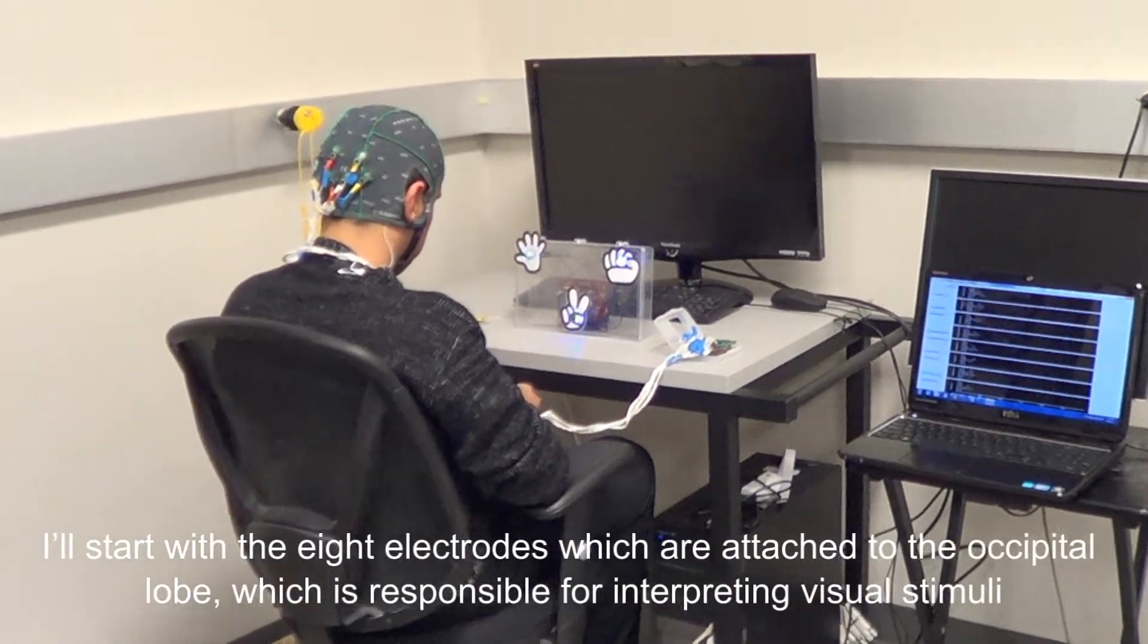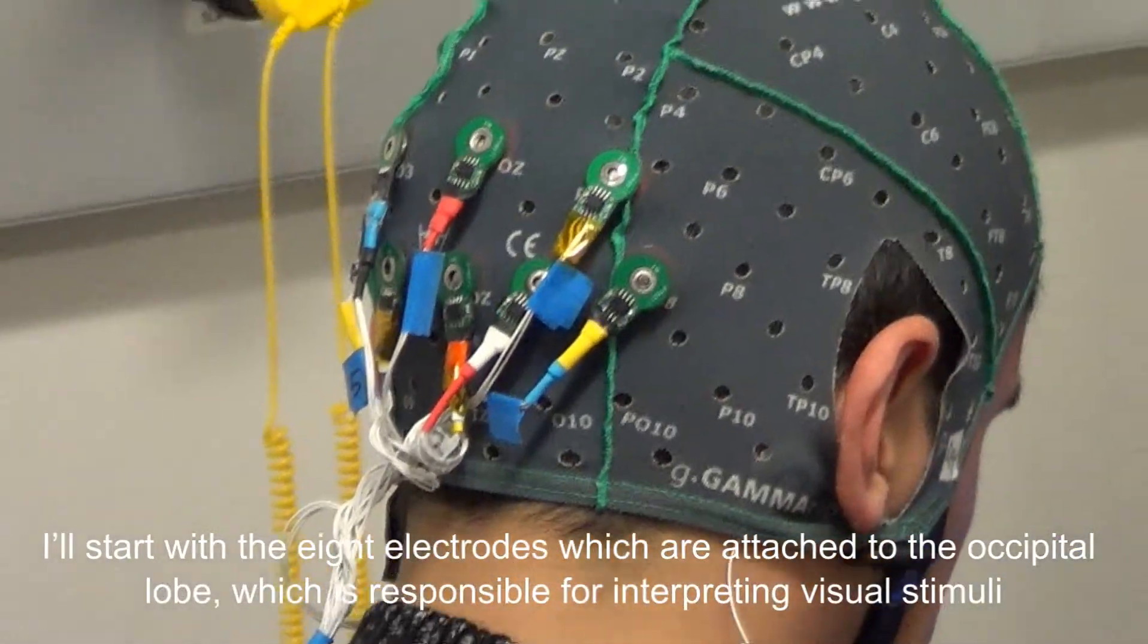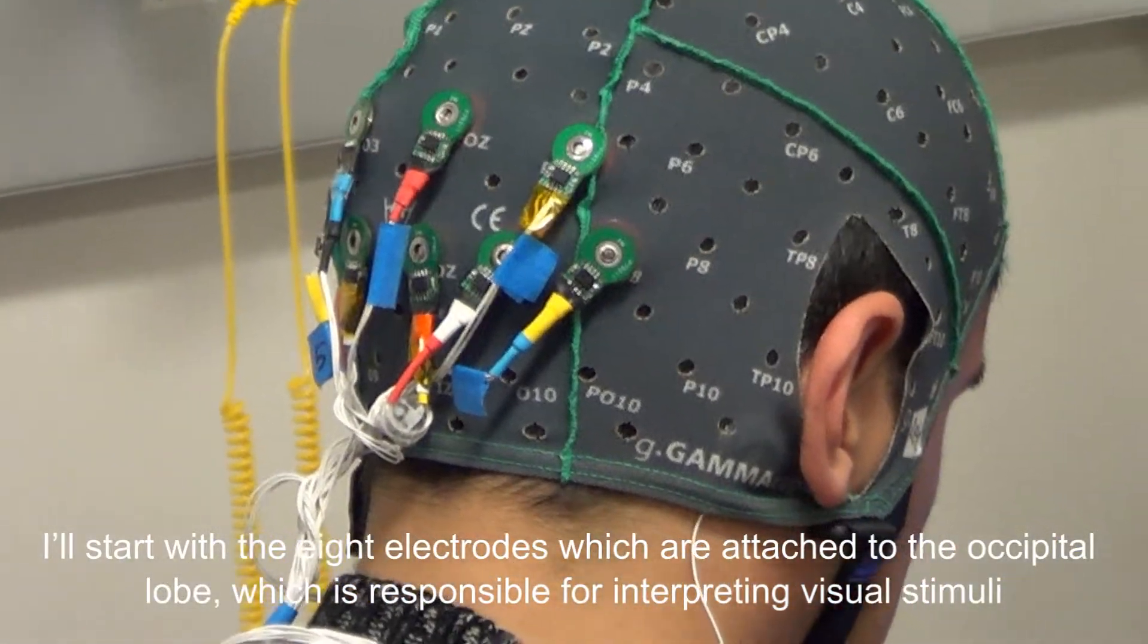I'll start with the eight electrodes which are attached to the occipital lobe, which is responsible for interpreting visual stimuli.